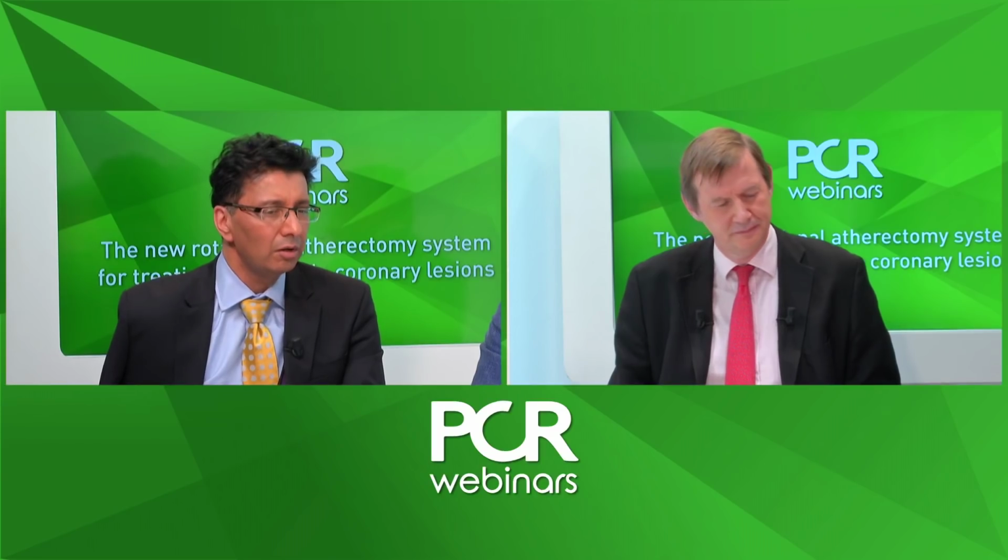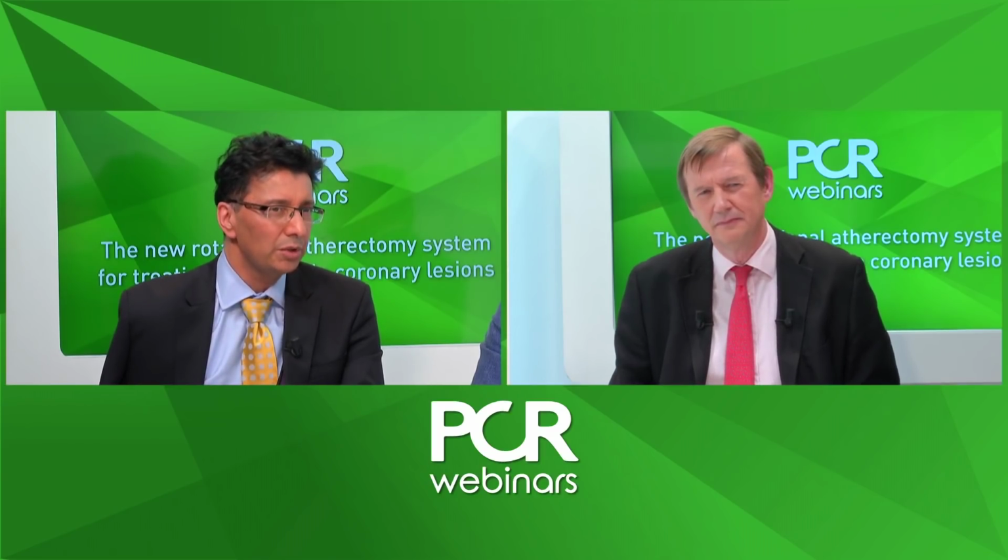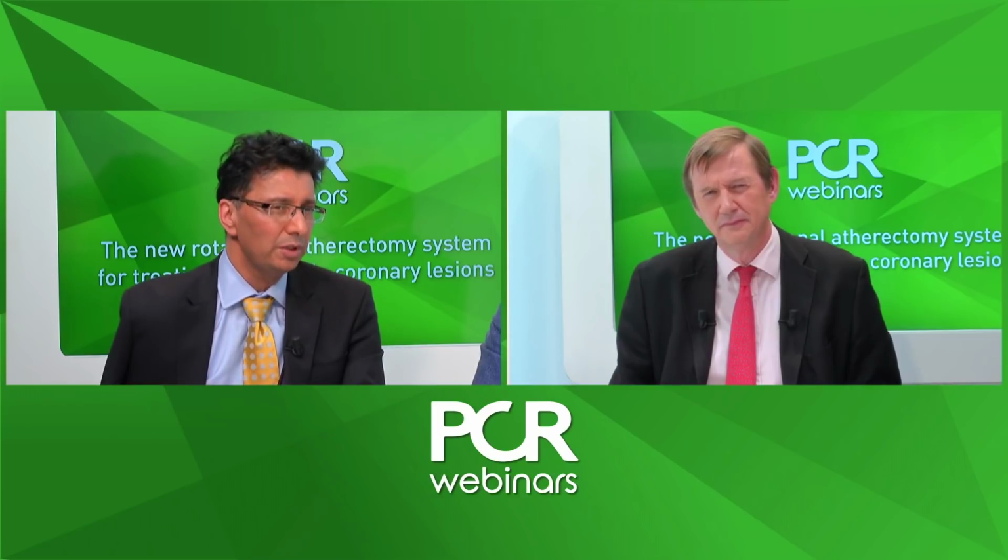is important. Obviously, there is a much lower complication rate with bleeding risks going from the radial artery. And I think with the modern technique of smaller burr sizes and knowledge that you can achieve in most cases with up to a 1.75 burr, it really means that the radial route can be used for nearly all cases. And there are sheathless guides also which enable you to use on those rare occasions when you need to use a 2.0 burr, also to go via the radial access.